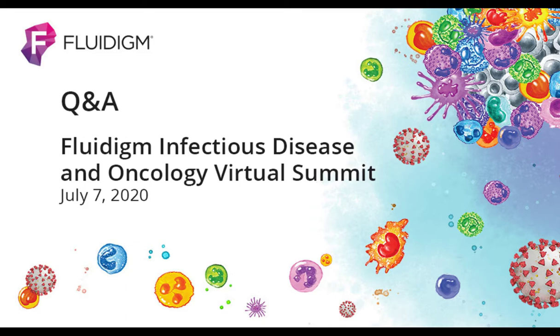And now, is your test a multiplex test? Yes. So we simultaneously detect, well, it depends. Let me explain what that means. We simultaneously detect 3 targets, N1, N2, and RNase-P. The sample is loaded only once into the microfluidic chip, but the targets are amplified in separate compartments of the chip, so there's separate reactions.